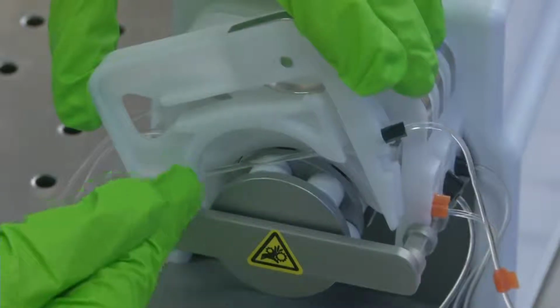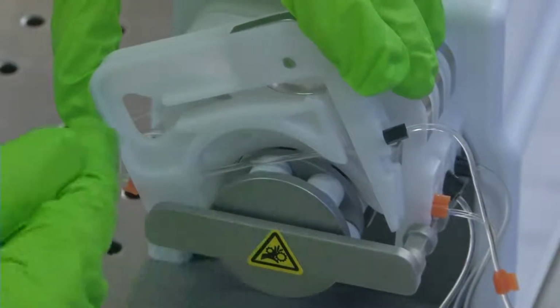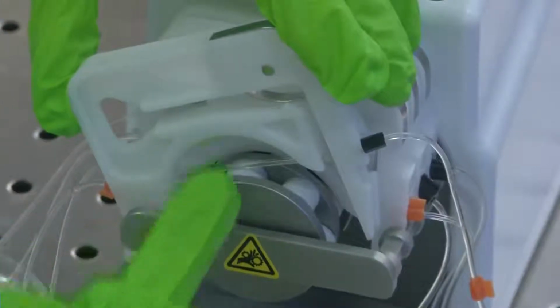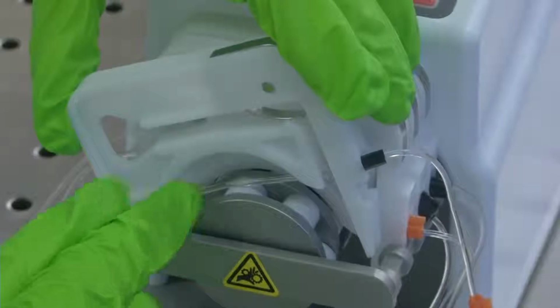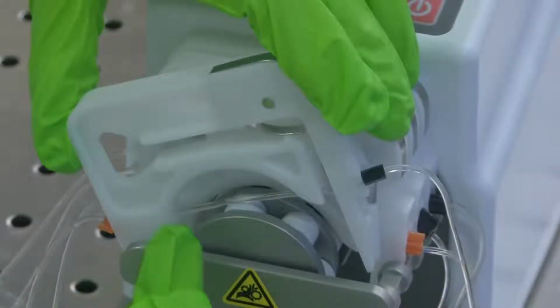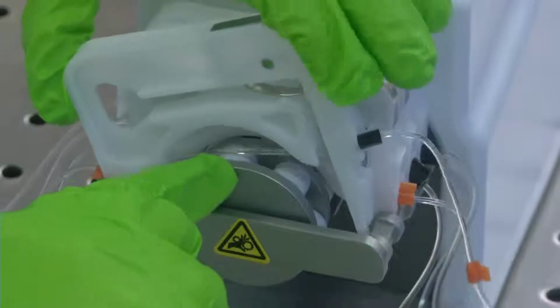between the two rollers there is a gap. As the roller moves, the part of the tube which is behind the roller faces the compression force, the one which is on the roller, and the one which comes between the two rollers is compressed, and then it resumes the shape as it goes away from the roller.